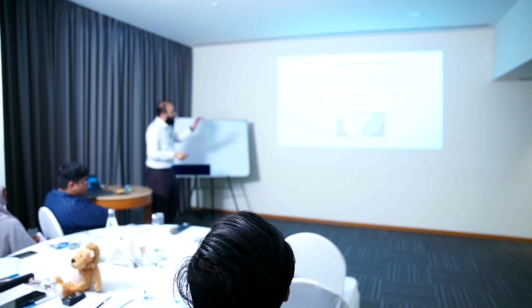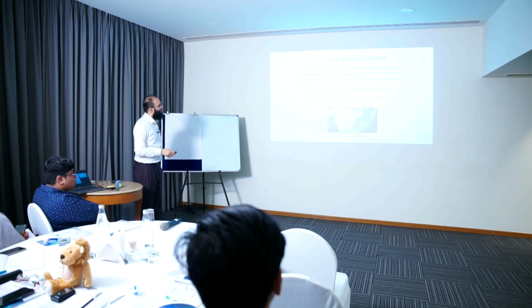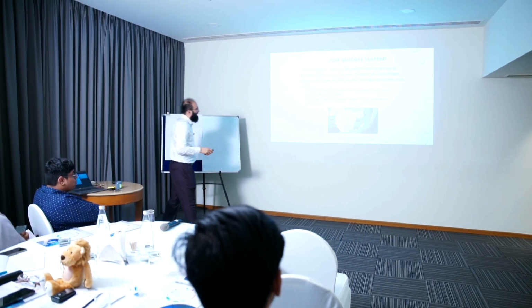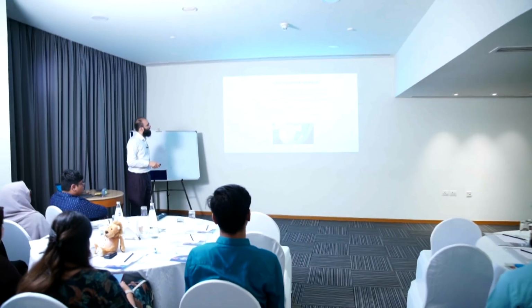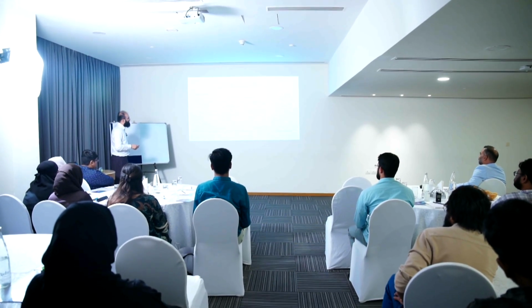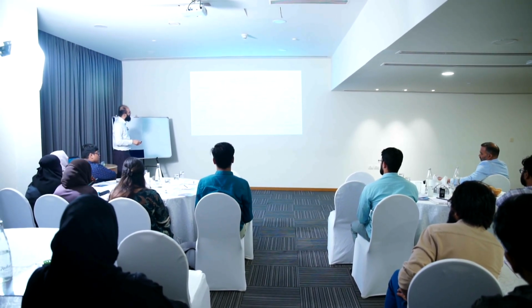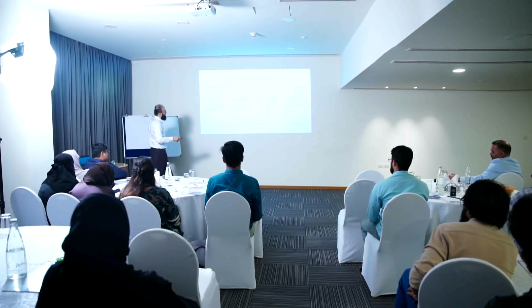So the Paradigm Veo is the world's first insulin pump equipped with a low glucose suspend function designed to help prevent severe hypoglycemia day and night. Greater confidence that one can potentially avoid severe hypoglycemic episodes. LGS may reduce the number of trips to the emergency department. So just an overview, developments addressing the current limitations for CSII and CGM. Insulin delivery patch pumps remove problems of malfunctions in the infusion tubing set. Algorithms minimize hypoglycemia by automatic adjustments in insulin dosing.